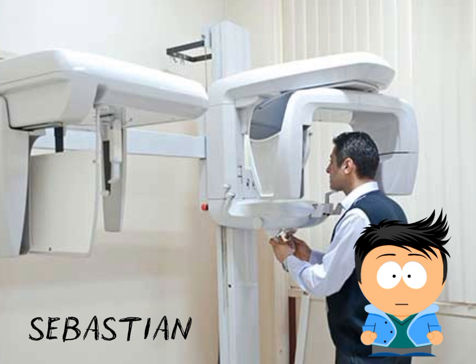Advantages are broad coverage and low radiation, between 4 and 7 microsieverts. Applications are identifying impacted teeth, and planning implants.